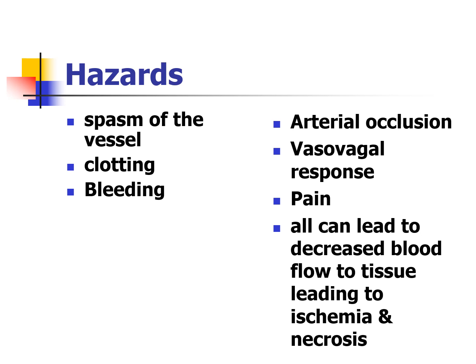So clotting and bleeding are some of the big ones, because you're puncturing an artery. Those are high pressure vessels. That's why they're such thicker vessels. And so if they're on blood thinners, there's a big chance for a bleed out if you do not do this appropriately. So I'm not trying to put fear or nerves. I just want to make sure that you are holding pressure, that you're checking for clotting issues for these patients. If they're in DIC, if they're on heparin, if they have low platelets, if they've had a lot of blood loss lately, that way you know that there's potential for hazards with that patient.